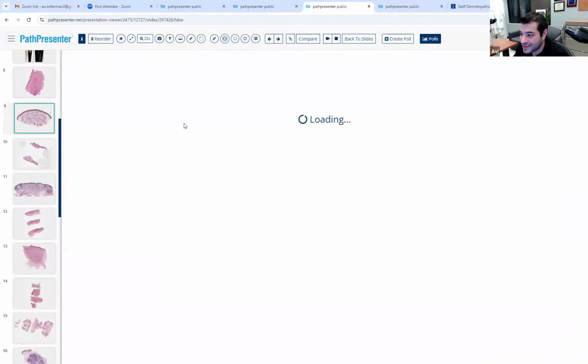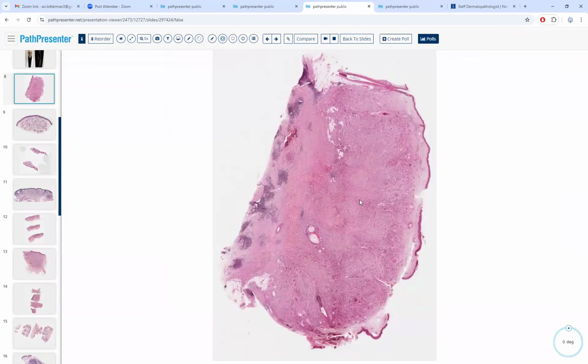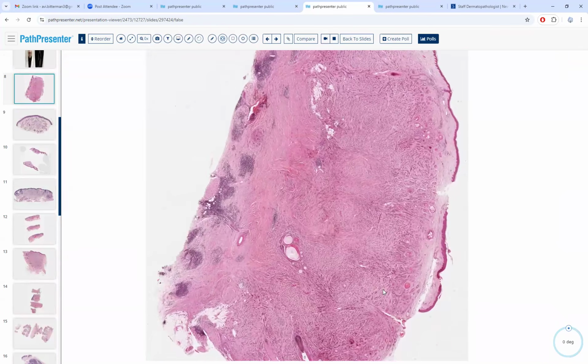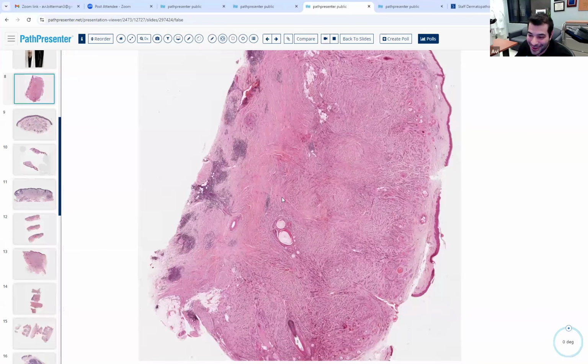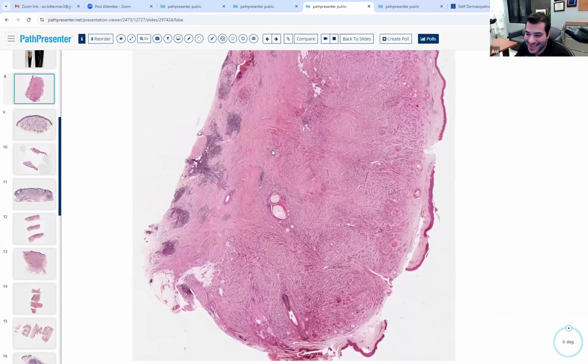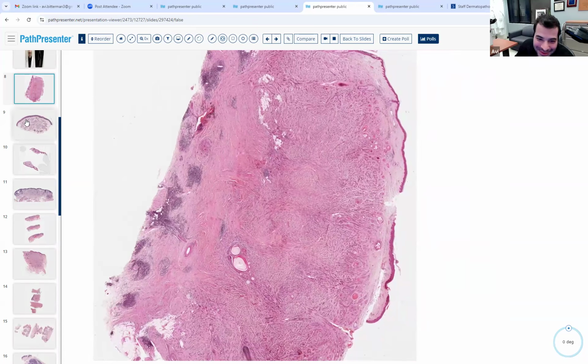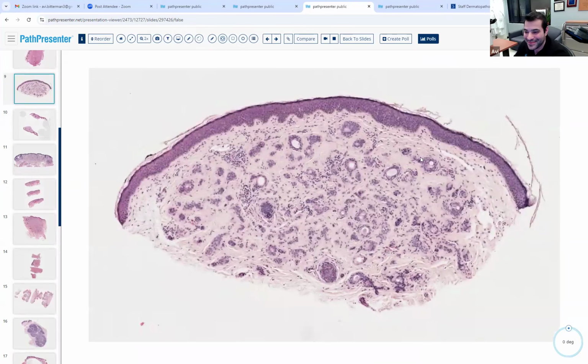One thing I'd say about this one, if people haven't seen very many MACs, this is comically large for a MAC. Most of them are not this huge. Most of them are fairly small. Yeah, this is a massive one. We're starting with the most pronounced examples, and then as we progress, we can get to the less obvious ones.